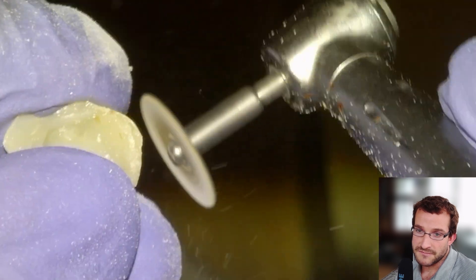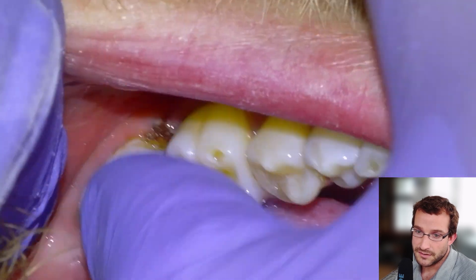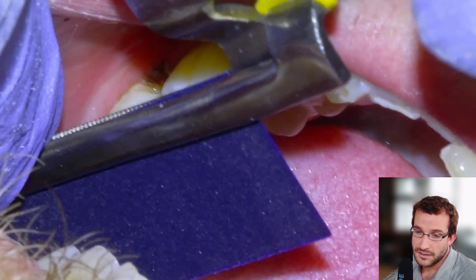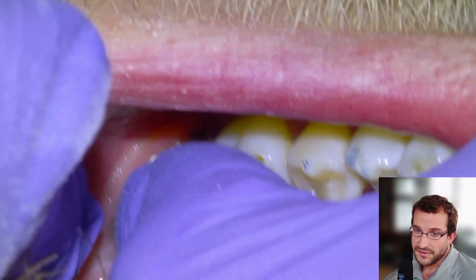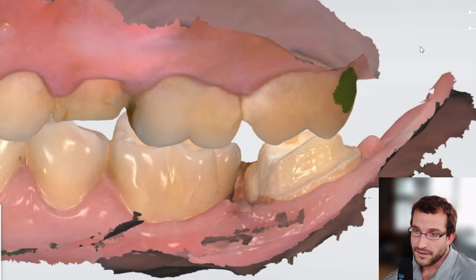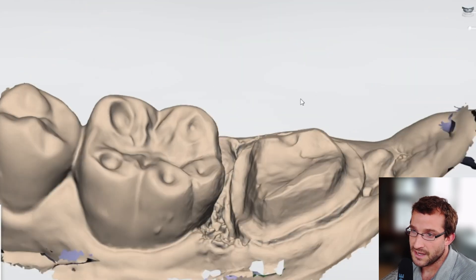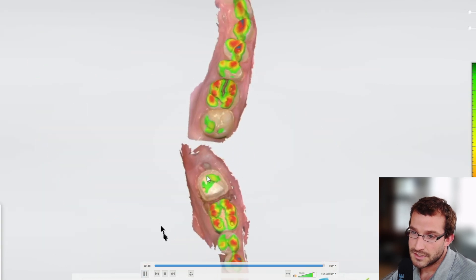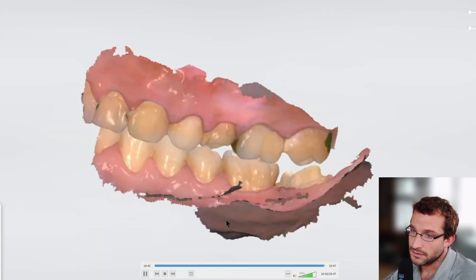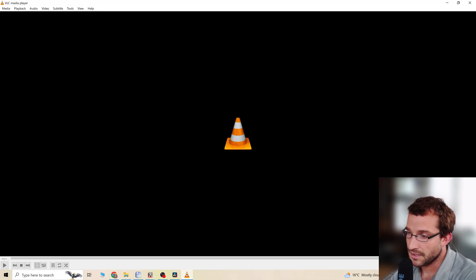We'll load up our template, which we would have taken preoperatively, trim it back down to the margins, try it in, check the bite, make sure that it's out of occlusion, and then load it up with some Temp Bond and fire it in. That's basically it for this one. There's the scan — that's going to work just fine. Good 1.5 millimeters of reduction, and there is the final after we had cemented it, which we're satisfied with.